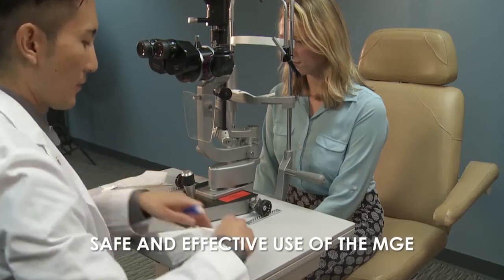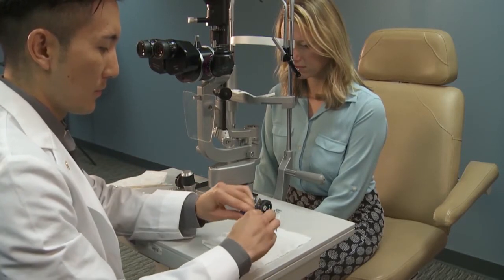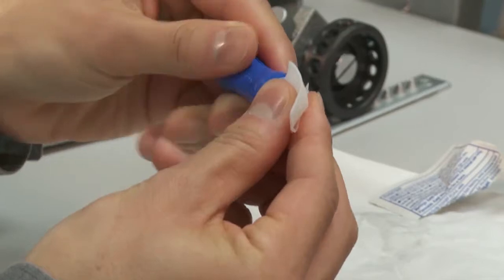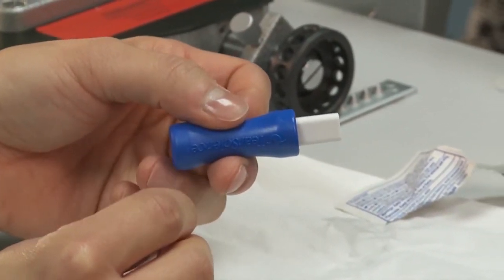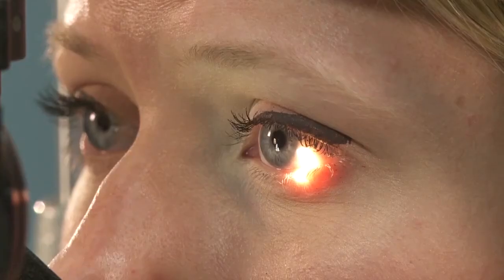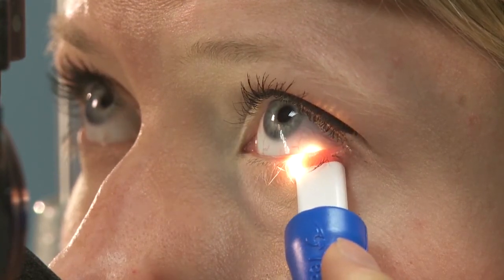Prior to use of the MGE, wash your hands and disinfect the MGE with 70 to 90% concentration isopropyl alcohol. Check for any rough surfaces prior to initial use of the MGE that may come in contact with the patient's eyelid. At the slit lamp, use 10 times to 16 times magnification. Locate the lower eyelid and instruct the patient to look up and away.